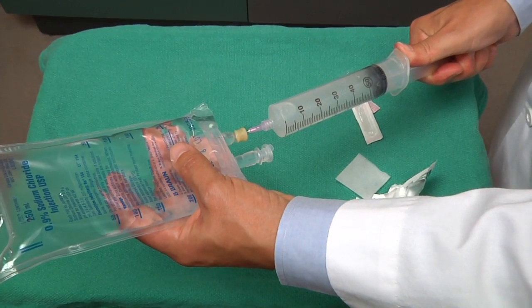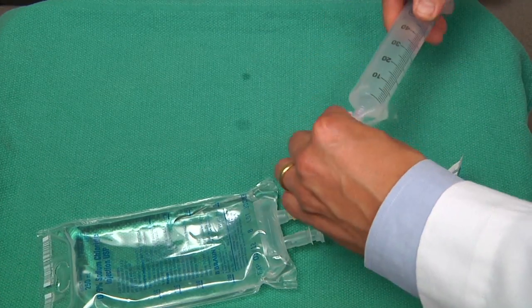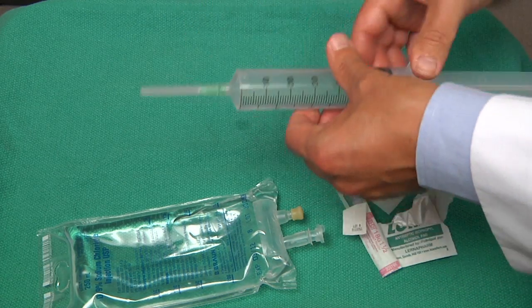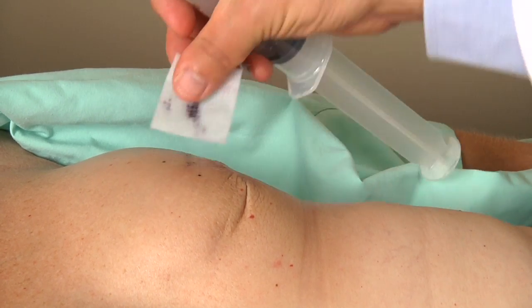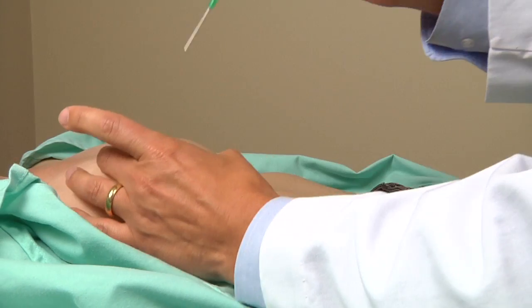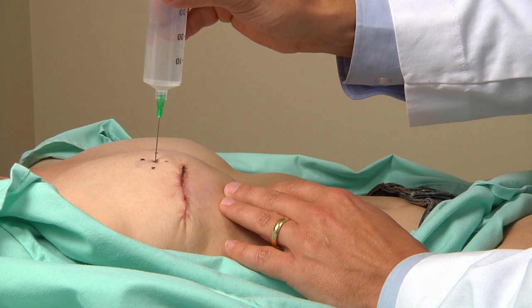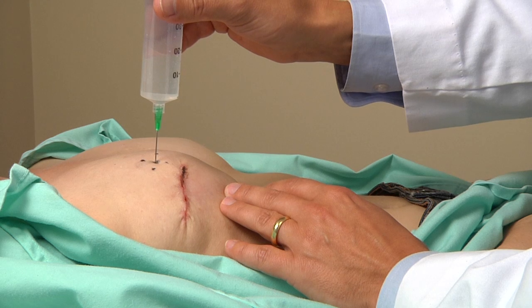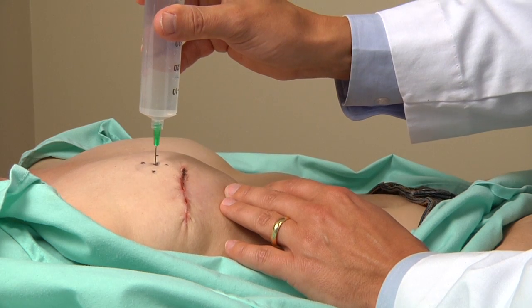Once the 60 cc syringe is filled with IV saline, the 18 gauge needle is exchanged for a 21 gauge needle or smaller, as the fill port will not seal after a larger bore needle. The 21 gauge needle going in at 90 degrees to the fill port will encounter some resistance going through the skin and muscle, then firmer resistance going through the fill port, followed by loss of resistance, and then firm resistance as the metallic end plate is felt.